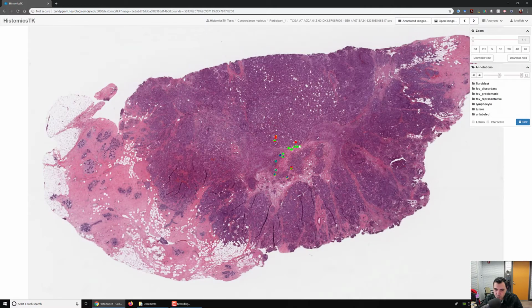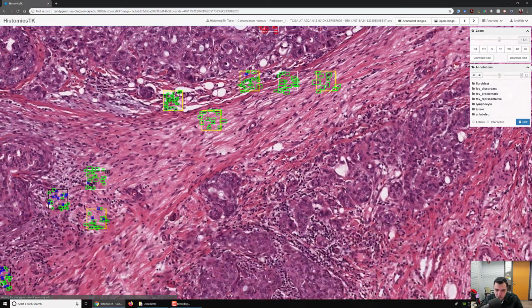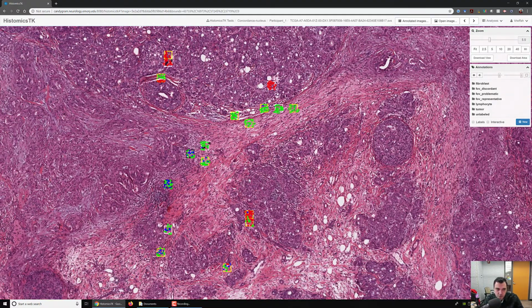And you can see a bunch of other ROIs. So you can see where this becomes difficult for you to zoom in and then move around and then zoom out. And then if you have like 80 or 100 slides, it just becomes difficult to quickly take a look at everything and review it. So that's what the annotation gallery feature is for.